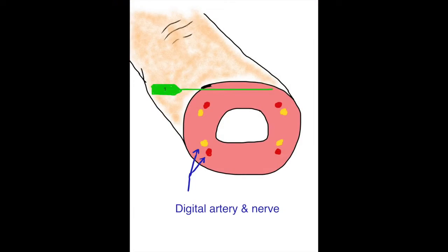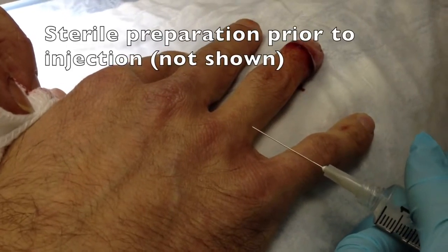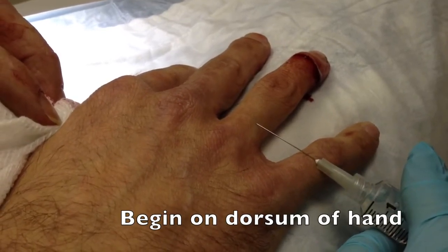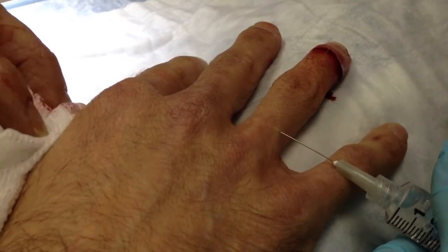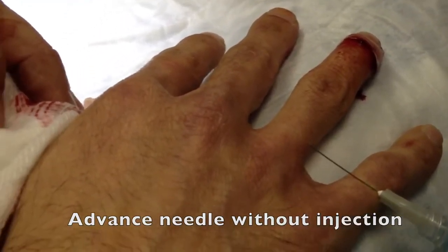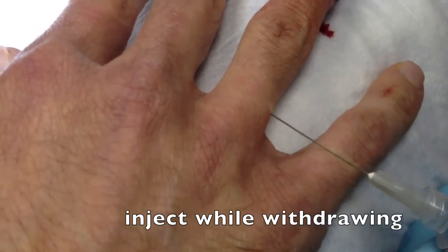My first injection will typically be across the dorsal aspect of the finger, which is the area with the least sensitive skin. I typically use a 27 gauge needle on a 10cc syringe using an anesthetic such as bupivacaine or lidocaine without epinephrine. The injection will go across the dorsal aspect of the hand. As with any injection, we advance the needle first without injecting, slowly aspirating on the plunger, and we only inject as we withdraw.